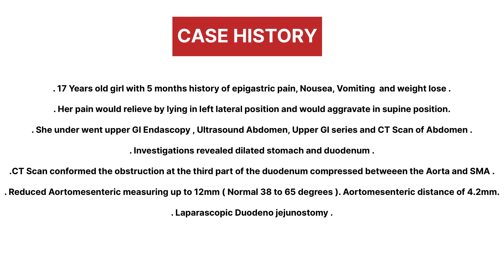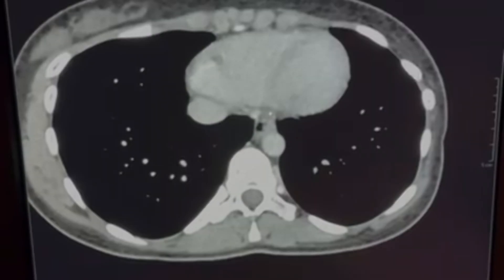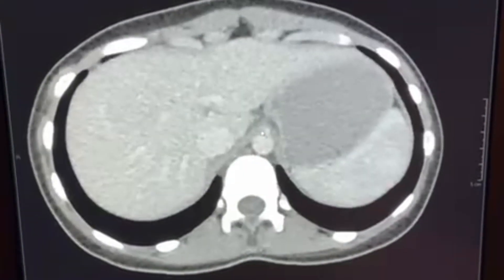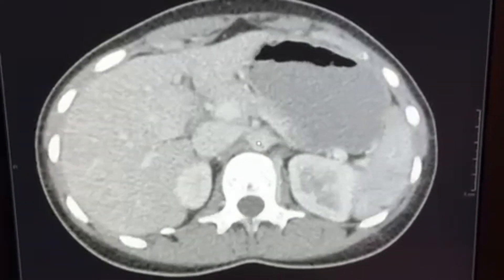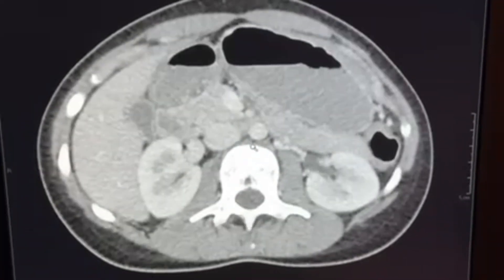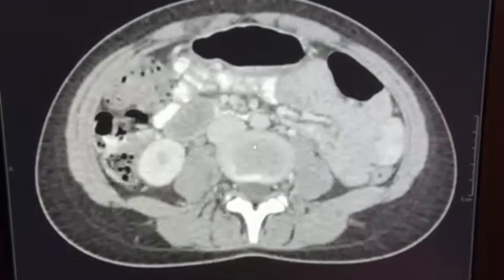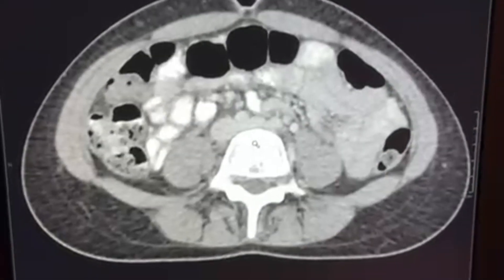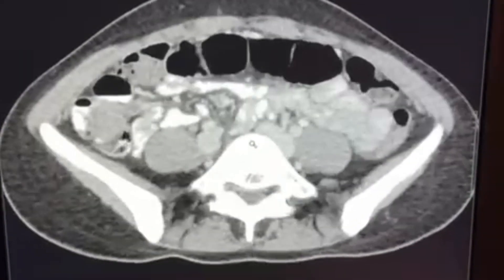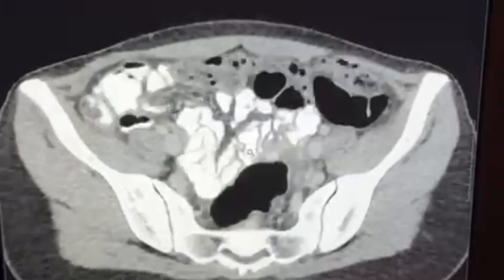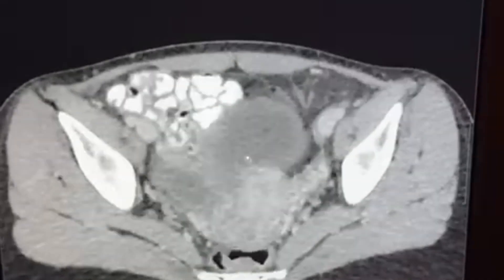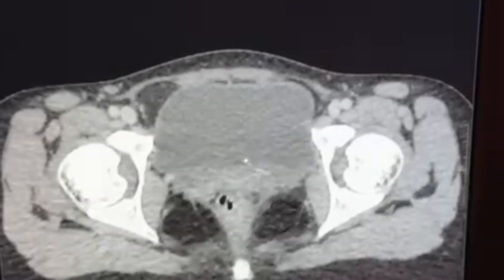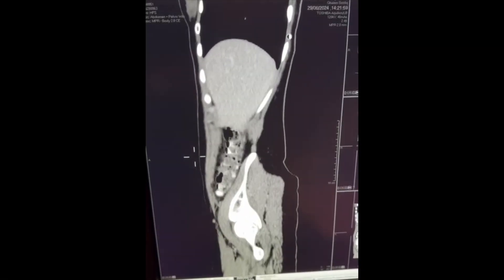After failed medical treatment, we planned for laparoscopic duodenal jejunostomy. We used a four-port technique: a sub-umbilical port for the camera and two working ports in the mid-clavicular lines. The left port was 12 mm and the right one 10 mm. A 5 mm port in the left anterior axillary line was for the assistant.